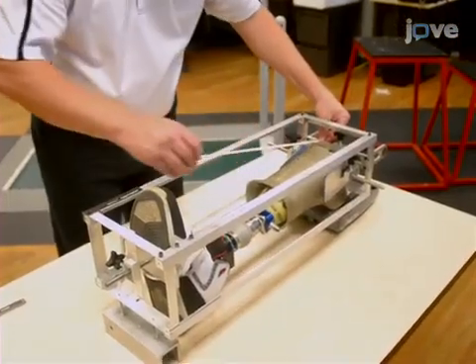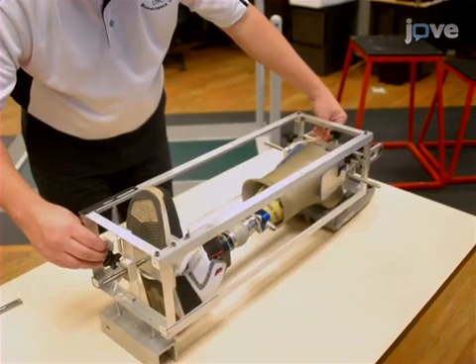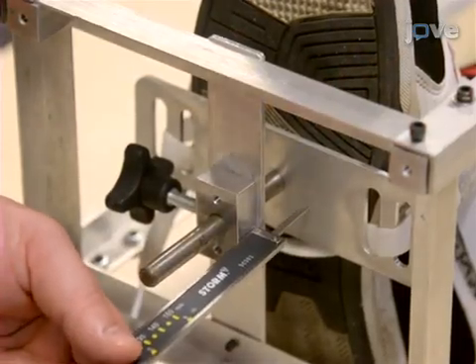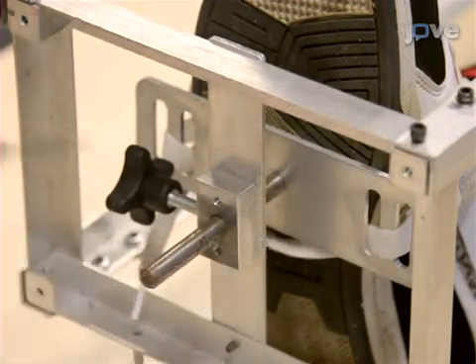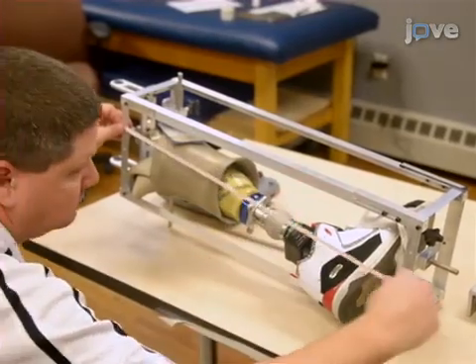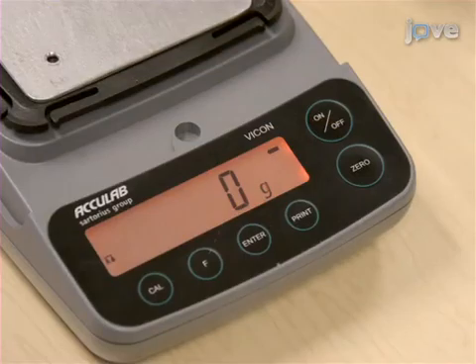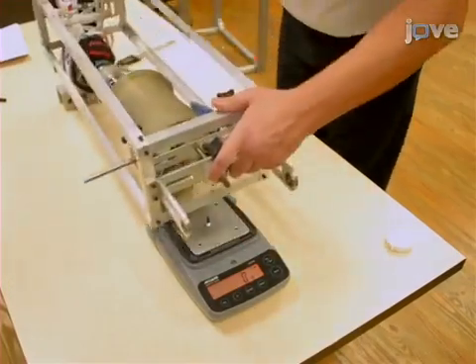Next, measure the distance between the bottom adjustable plate and the fixed cross member at the top of the inner cage, and determine the distance between the bottom adjustable plate and the fixed cross member at the bottom of the inner cage. Then, measure the distance between the 2 knife edges. After taring the scale to 0, position the rack and prosthetic limb in the reaction board assembly.